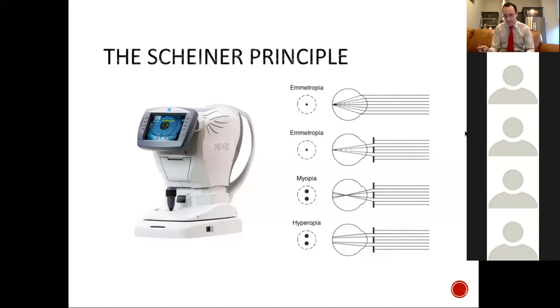And we know the autorefractor projects infrared light and it gathers measurements from the way this light is reflected back from the fundus. So within this double pinhole aperture system, I'd like to review conceptually what we're achieving here, okay? So these circles I have here that I'm filling in with the green, those would represent your pinholes.